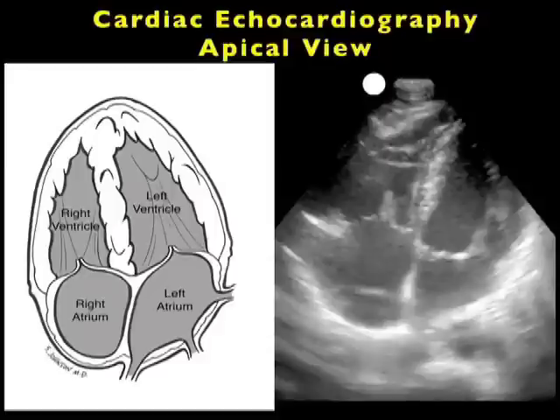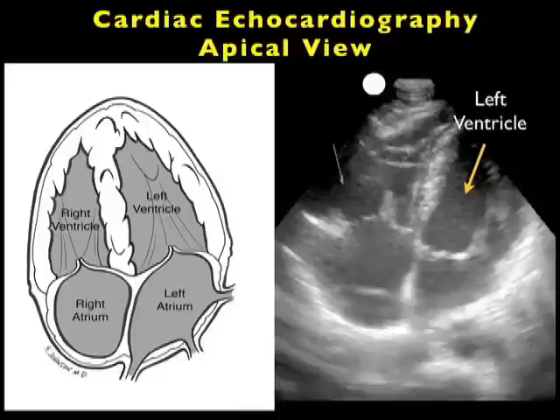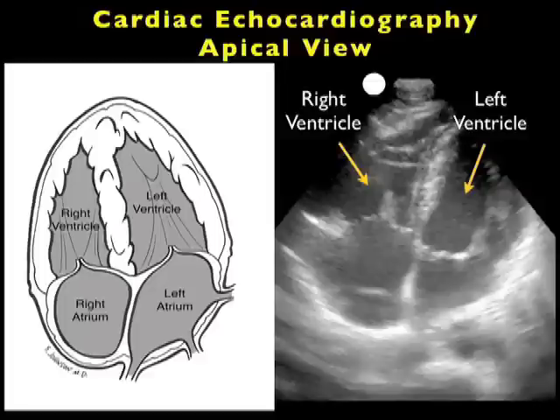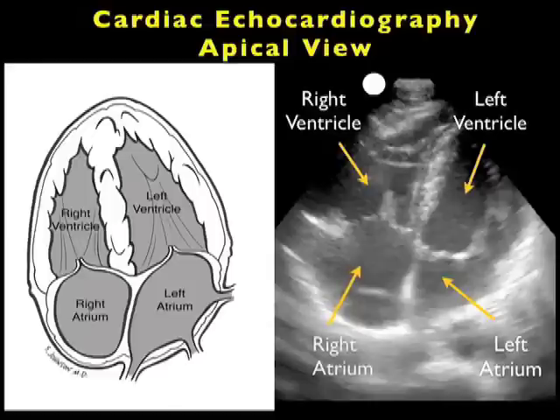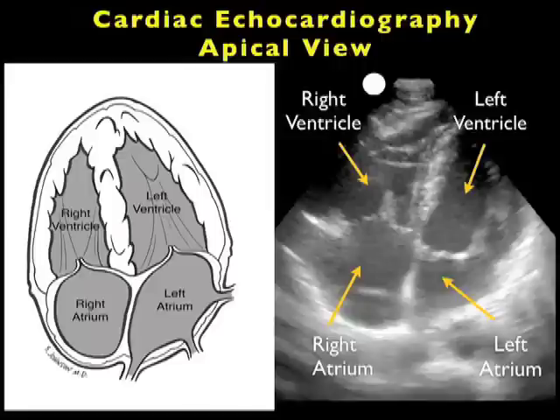Now let's learn how to interpret the images that we'll obtain. We see here a pictorial to the left and an ultrasound image to the right. As we're imaging from the apical view of the heart, we're closest to the ventricles. We see the left ventricle to the right of the screen and the right ventricle adjacent. The atria will be further away, posterior to the ventricles — the left atrium just below the left ventricle and the right atrium below the right ventricle. We also see the valves: the tricuspid valve to the left and the mitral valve to the right in between the left atrium and left ventricle. We can also appreciate the white lines surrounding the heart, which is the pericardium.